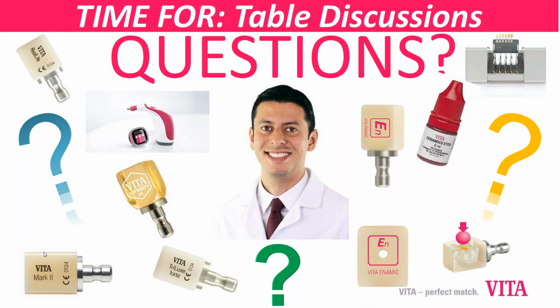So there's a comment by Mr. Felix Pages. He uses facial veneers with different values and tries them in, they have them in 0.5, 0.7, and 1 millimeter thicknesses. A comment by Mr. Pages.